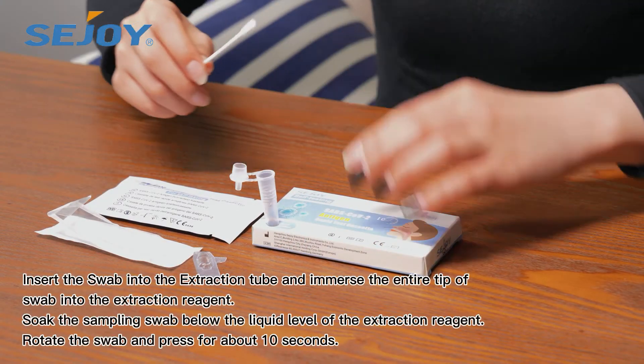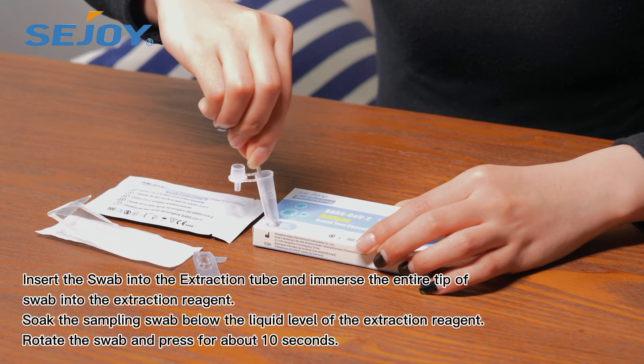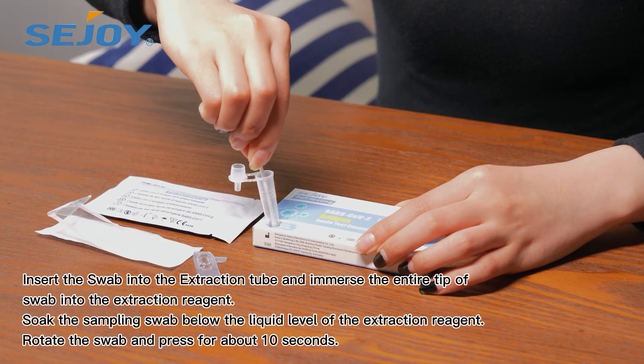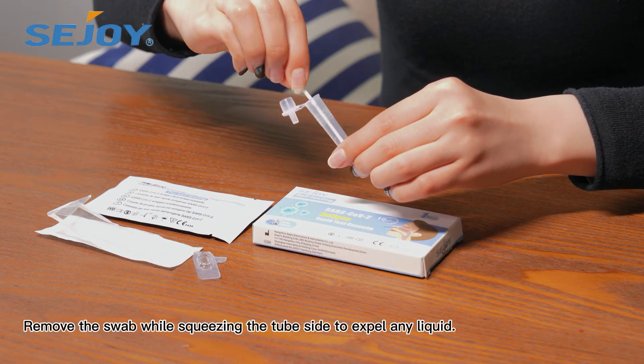Insert the swab into the extraction tube and immerse the entire tip of the swab into the extraction reagent. Soak the sampling swab below the liquid level of the extraction reagent. Rotate the swab and press for about 10 seconds. Remove the swab while squeezing the tube sides to avoid spilling any liquid.